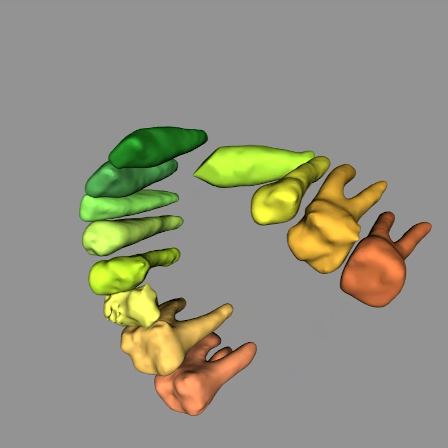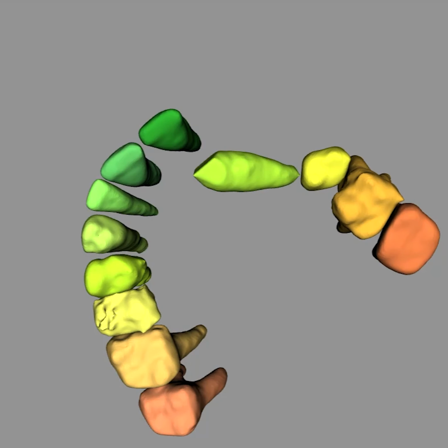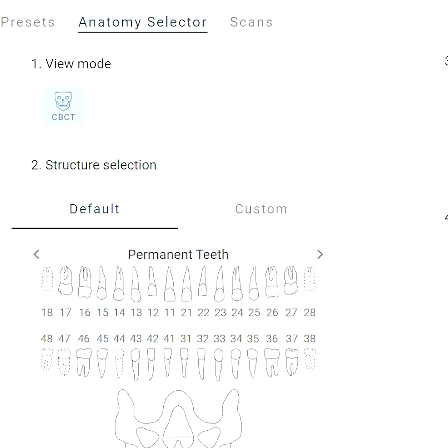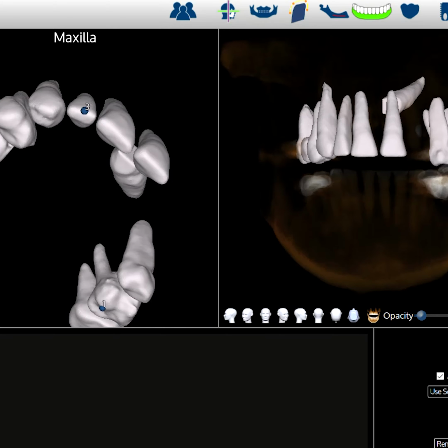And what I did then was I virtually extracted the lateral and the premolar, the two teeth that I had planned to remove at the time of surgery, and then I exported out as one file the remaining maxillary teeth with the roots. Then I brought that STL file into my X-Guide treatment planning software, and I aligned that onto the patient's CBCT.